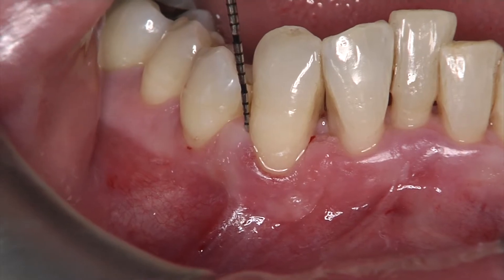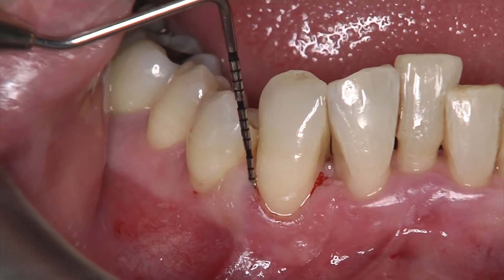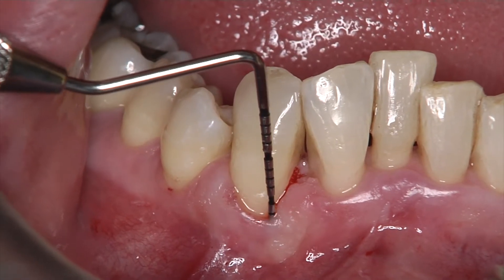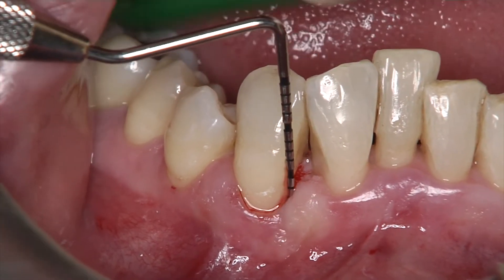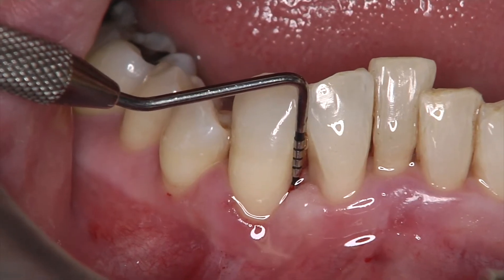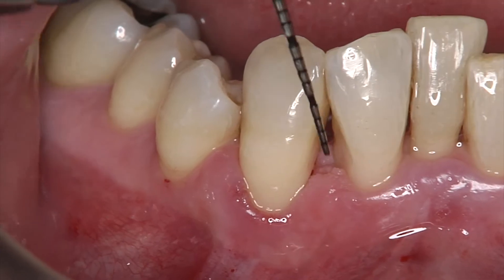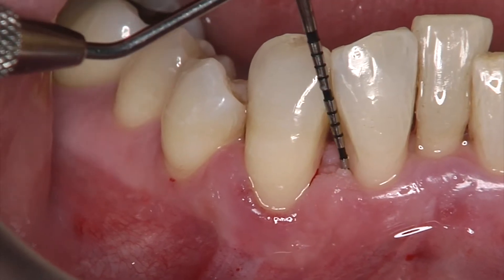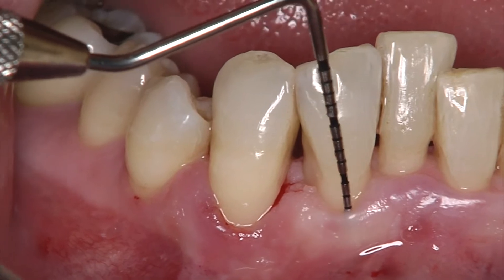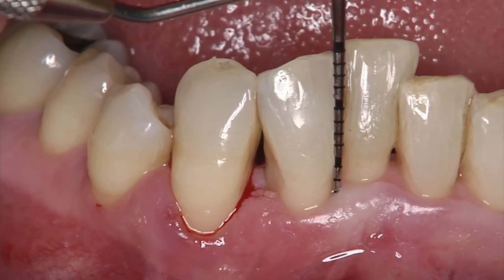The single flap approach represents a simplified procedure that allows surgically accessing intra-bony periodontal defects by raising a single vestibular full thickness flap, either buccal or lingual, depending on the defect extension. The procedure in this video is performed to regenerate an intra-bony defect between the lateral incisor and the cuspid in the lower jaw.